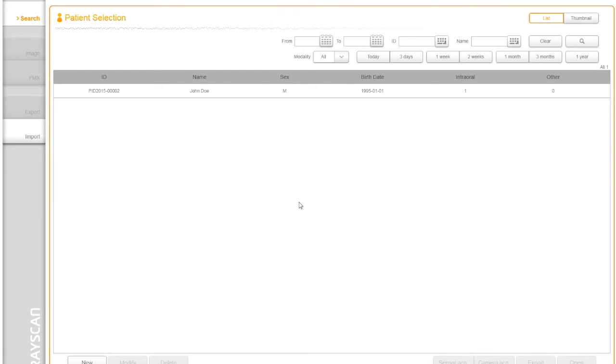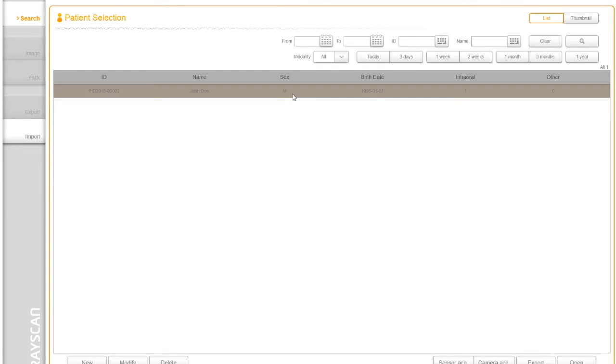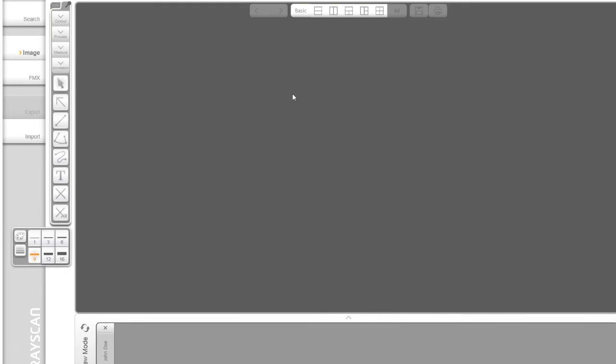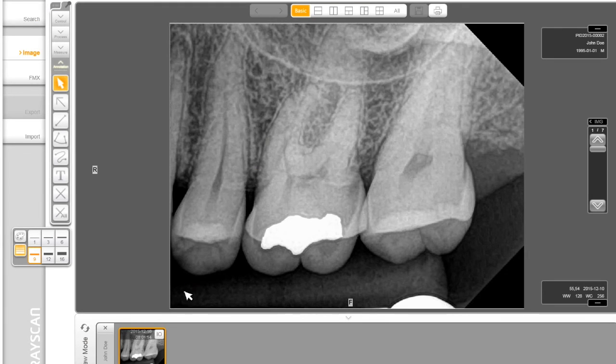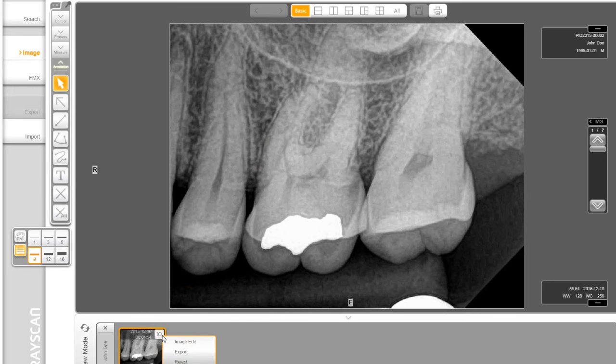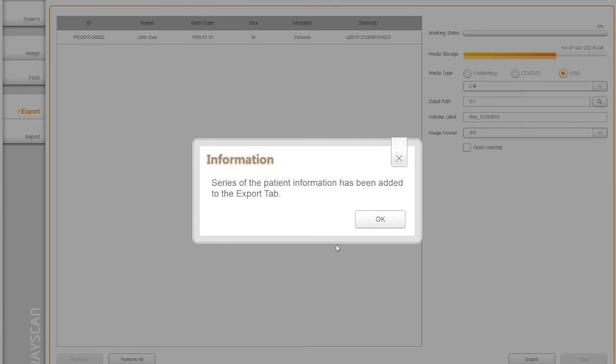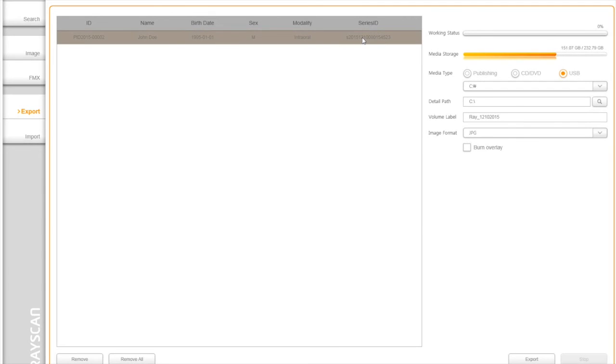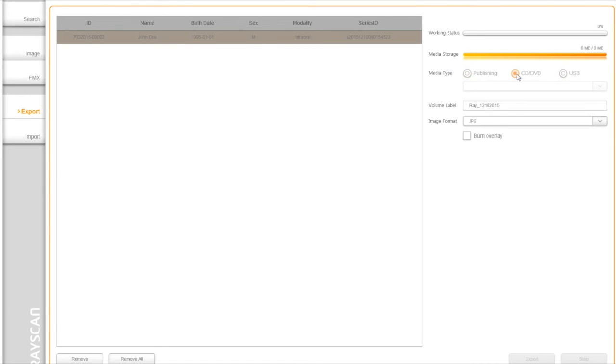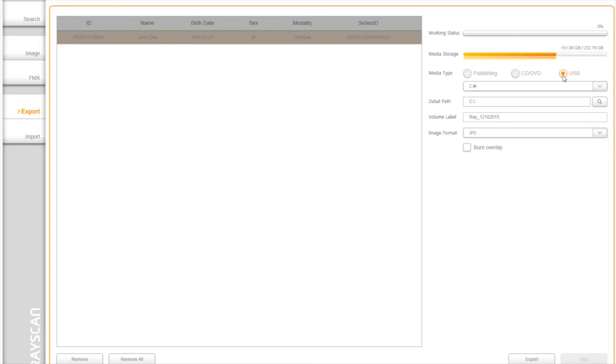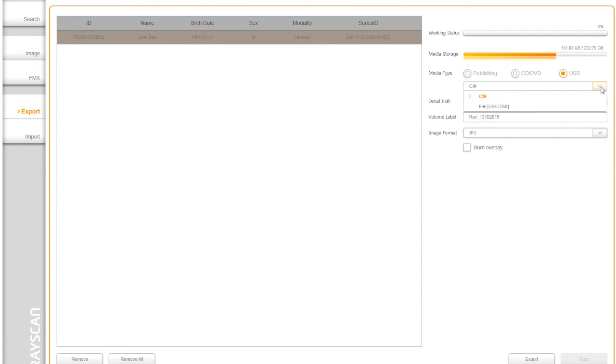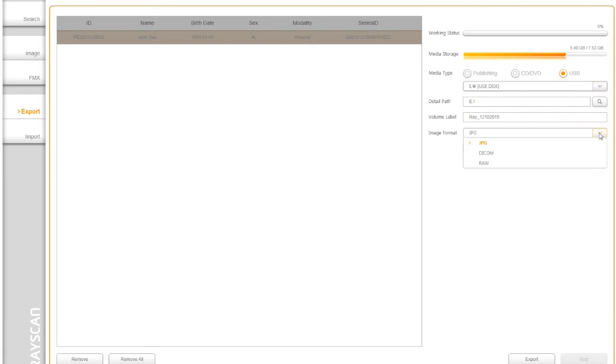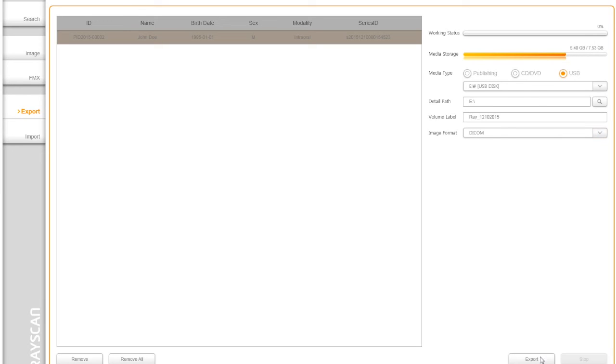In order to export an image outside of RioView, choose the image and click on the small selection icon in the layout. Then, click Export. This utility provides the media type, such as Publishing, CD, and USB as your preference. Note, the publishing option comes with web-based viewer with the selected image. RioView allows users to export files to any location on the computer with JPEG, DICOM, or RAW format. And then, simply click Export button to finish the process.